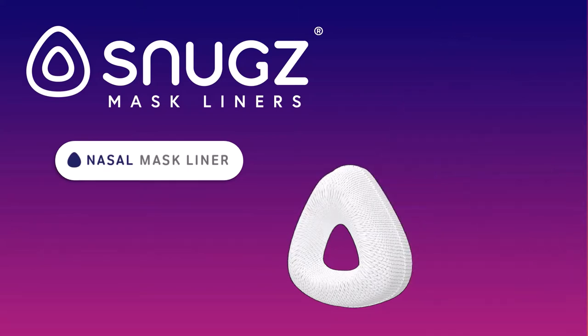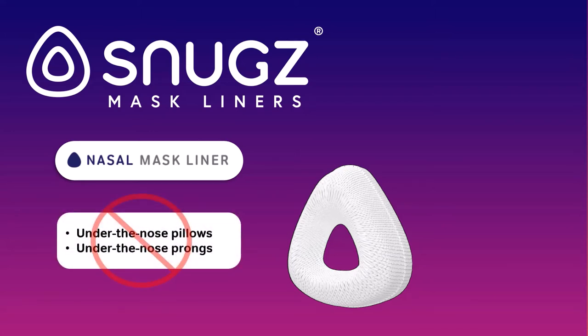Here we are going to show you our nasal mask liner, which works for all sizes of most masks that go around your nose only, but not under the nose pillows or prongs.